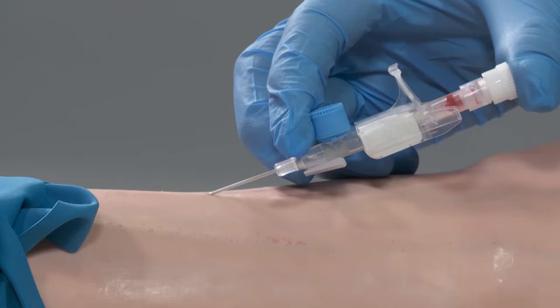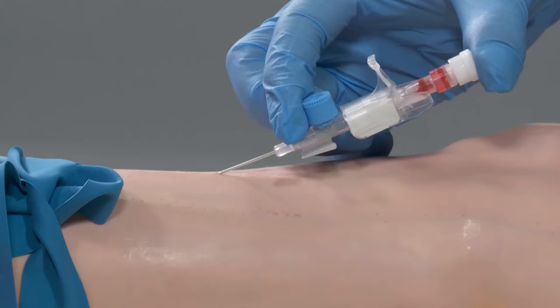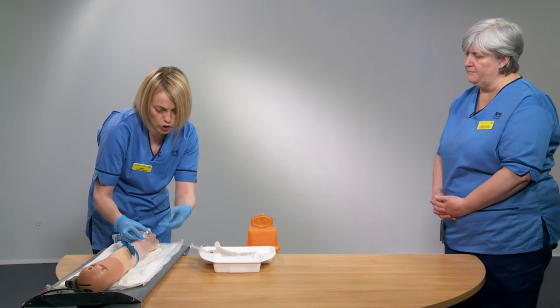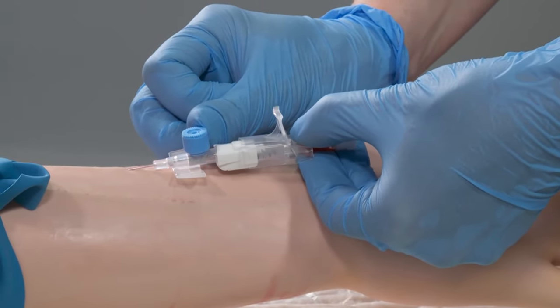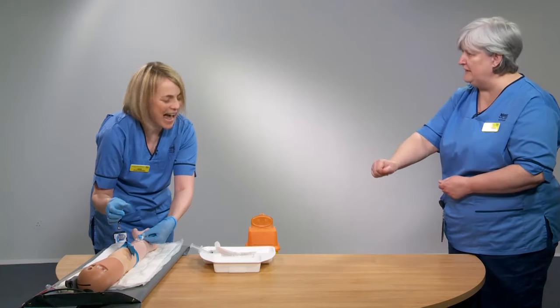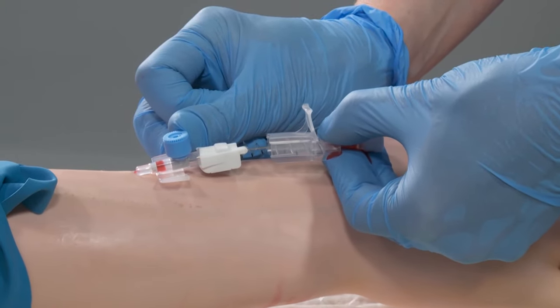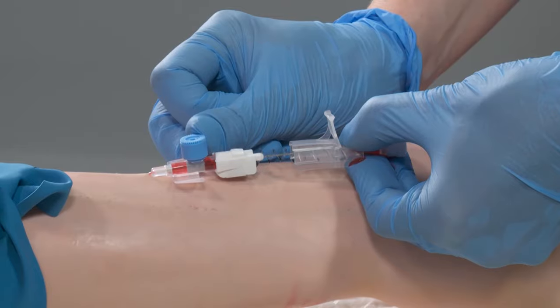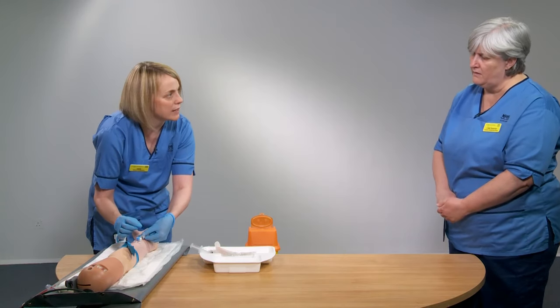Can you see the blood appearing in that chamber? What's really important at this stage is that you change the angle — flatten down ever so slightly and then reposition your hands. With my left non-dominant hand, I'm going to pinch the back of the device, and with my right hand push the hub forward, so the two components of the cannula are separating — you're advancing the cannula off the needle. If I'm successful you'll see a second flashback traveling up the cannula. You can see blood in the chamber at the front, and the needle hasn't moved.